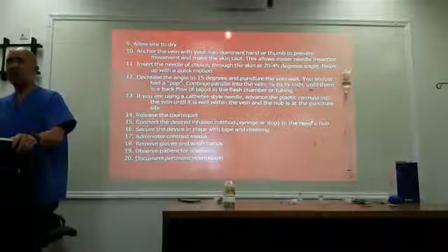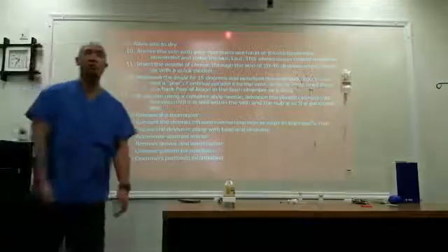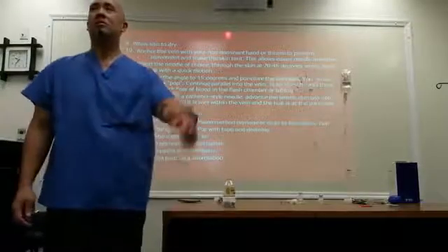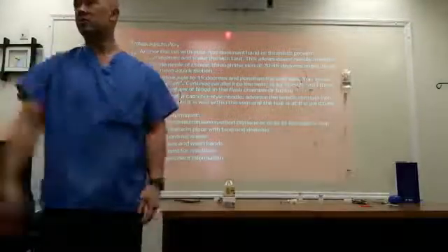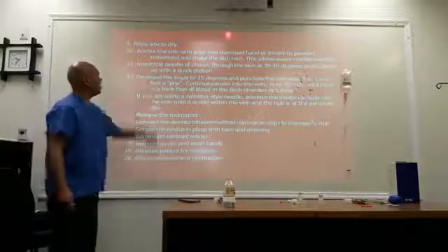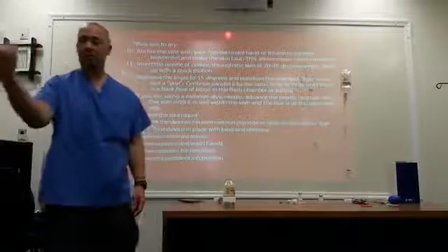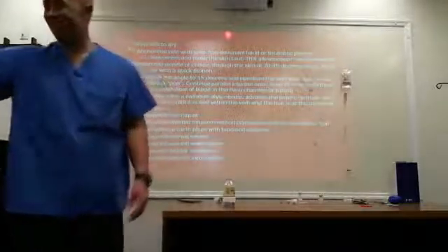If you have someone who has a vein that moves around, who's wearing short sleeves? Okay, so number 10, it says anchor the vein with your non-dominant hand to thumb to prevent movement. Come on, stand over here. Okay, give me your arm. Okay, see your vein?